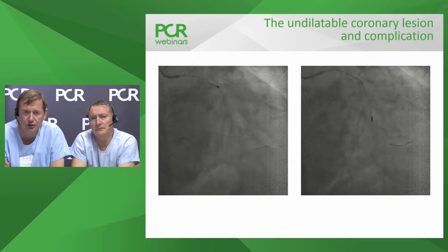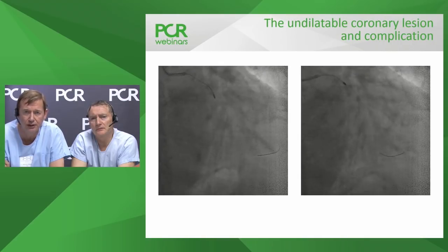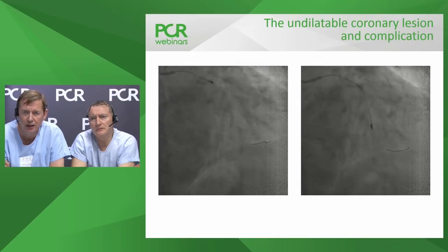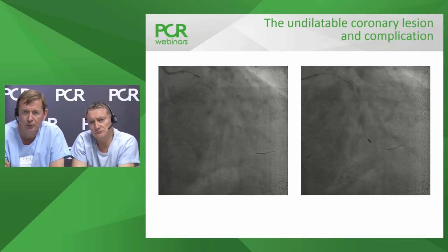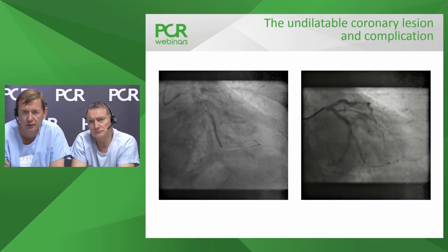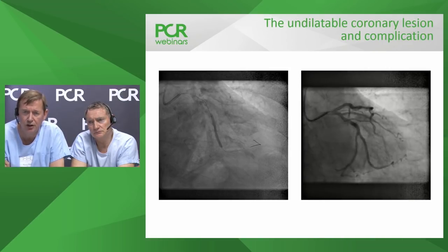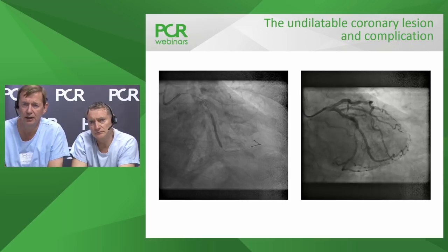And because of the tortuous nature of the lesion, it was done in a very stepwise, careful way of dealing with the proximal lesion first, and then on the second run, eventually got down to debulk the origin of that second calcific marginal, and was able, after some stenting, which I think is coming up next. And you can see that the first marginal artery has now been fully stented, and the second marginal artery has also been stented, I think with the help of a bit of support from a guideline catheter.